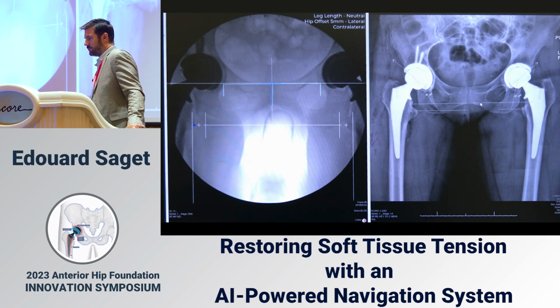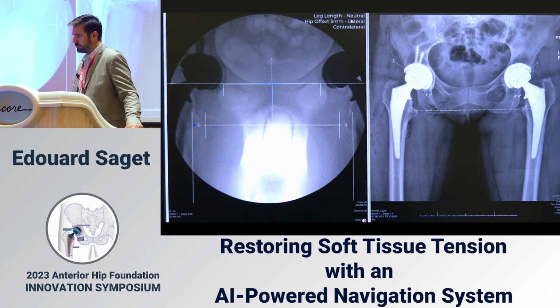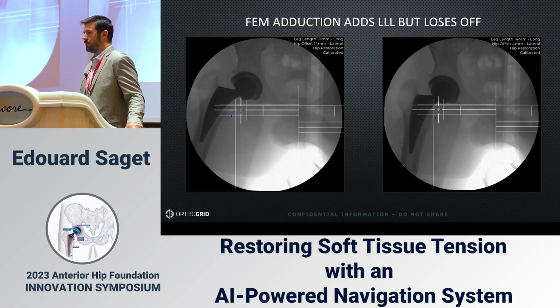But you can see that's a pretty good line with the bottom of her obturators, pretty good line at the bottom of her ischia. And so I'll take that as a reasonable line. Limb lengths, we look spot on in terms of side to side. So I'll accept that that neutral was right. So the AI was telling us what we needed to. And there are some things to consider.